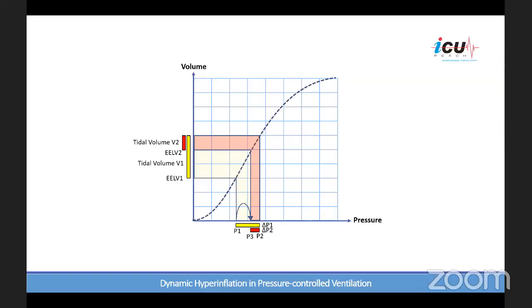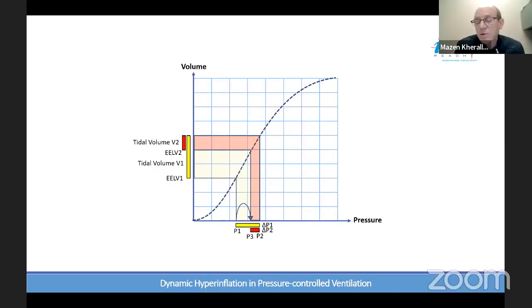Thank you. A few more questions. ARDS with asthma is a really challenging case. How can we approach it safely? You need to maintain the principles of protective lung strategy, meaning that the plateau pressure should not go above 30, the driving pressure should not go above 15, PEEP should be adequate for the patient.